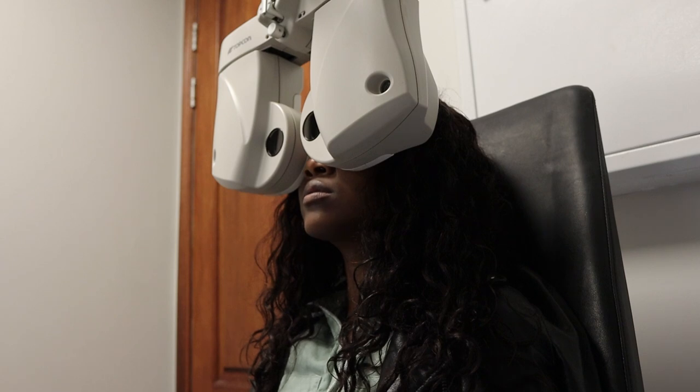Can you see the dots over there? Yes. Are those clearer and rounder lens 1 or 2? 2. And 3 or 4? Please repeat again. 3 and 4. 3. Can you see the 5? Yes. Where would you say that's clearer? 5 in red or 5 in green? 5 in red. Red. And over there? 5 in green. And over there? 5 in red.